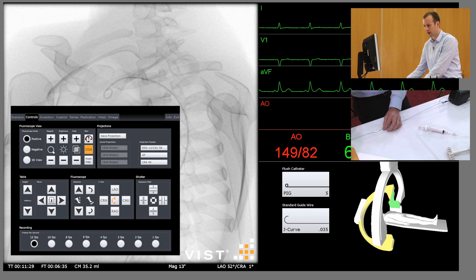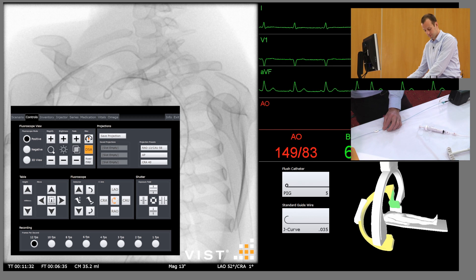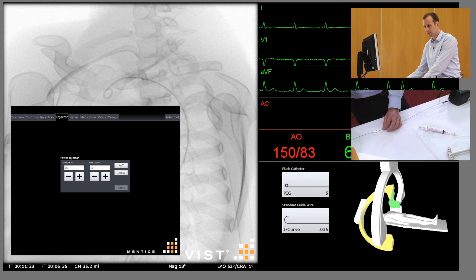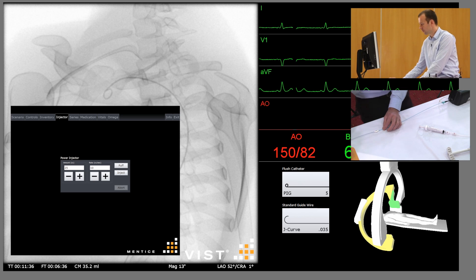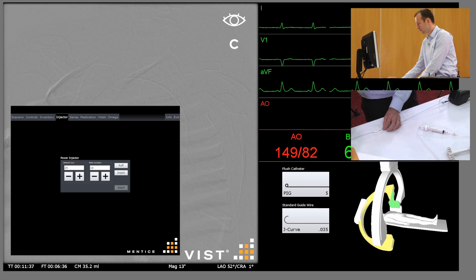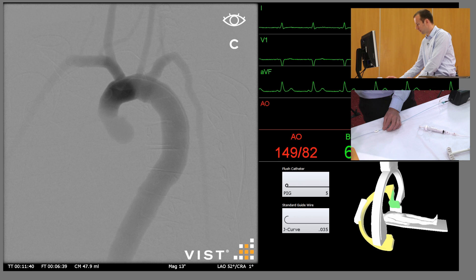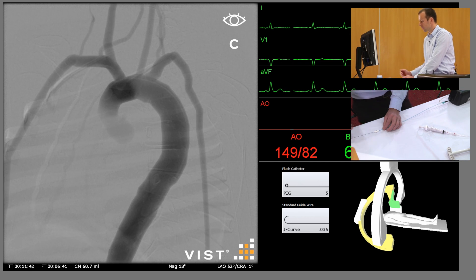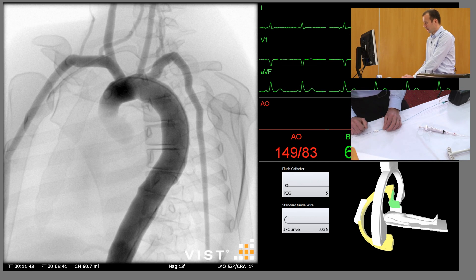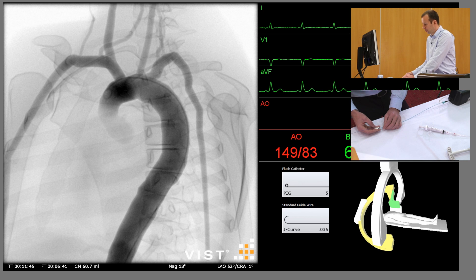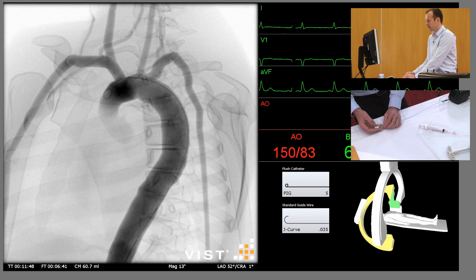Make sure DSA is selected, and inject the contrast. And there you can see a clear view of all three arch vessels: the innominate, the left common carotid, and the left subclavian artery.